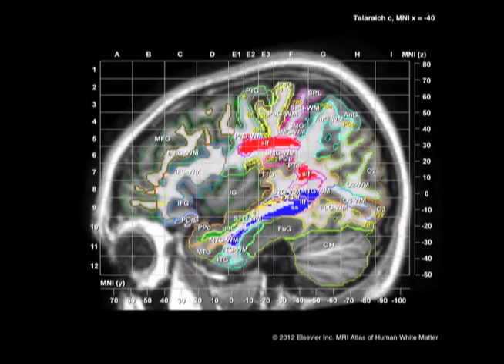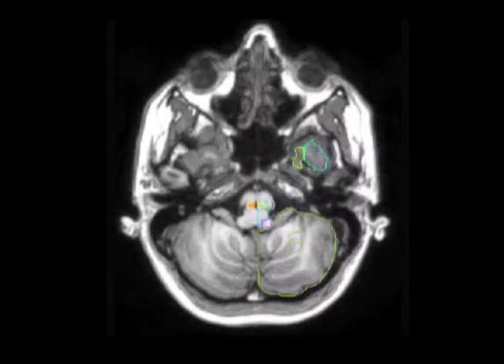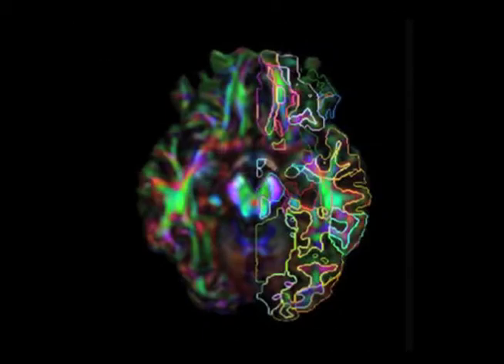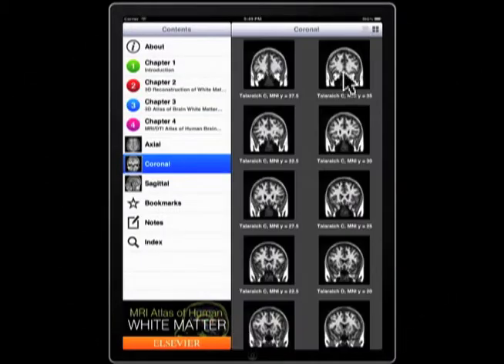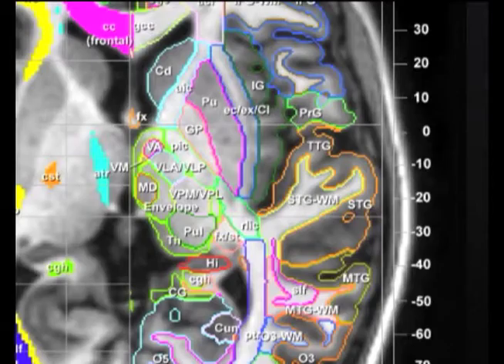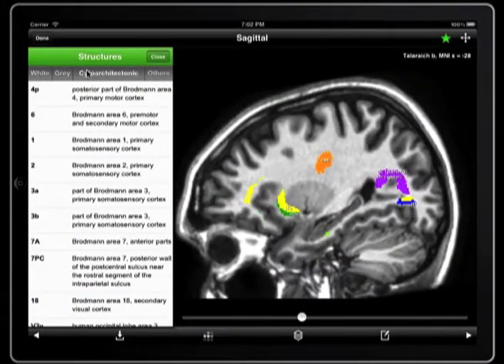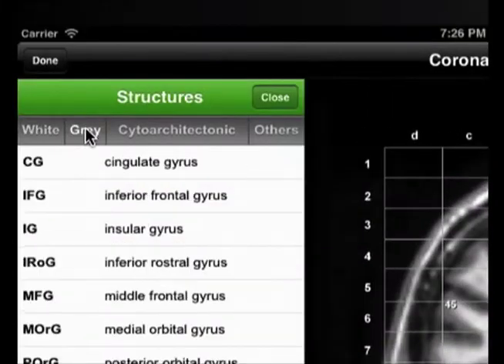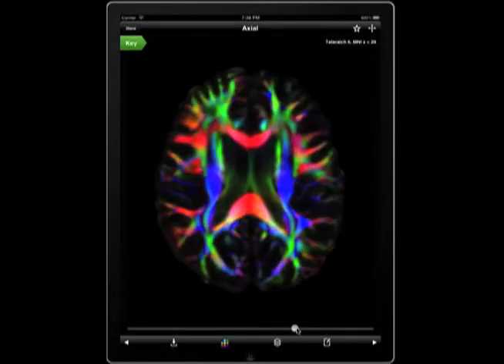The app is based on the MRI Atlas of Human White Matter by Ken Oishi, with additional MRI and DTI imaging work conducted in the lab of Susumu Mori. These researchers recognized that an app would allow more interactive and useful ways of delivering the information, and provided access to the original images from the MRI and DTI to create this tool.